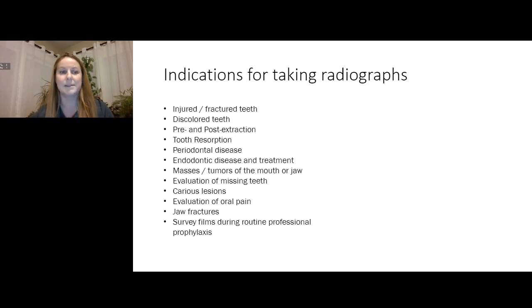Another thing, periodontal disease. When we talk about that, it's perio meaning around, odont meaning tooth. So periodontal disease of those structures around the teeth. And we're going to get into this, but that's when we're looking at our bone height in particular. We see these patients in our exam rooms and we're identifying, I think this is a stage this or a grade this, or however your practice is doing things. And you're kind of scoring maybe your dental procedure in advance of getting in there. And maybe you're saying that based on what you saw for periodontal disease or suspected bone loss prior to the procedure. And that's really going to tell you what you have going on for that.